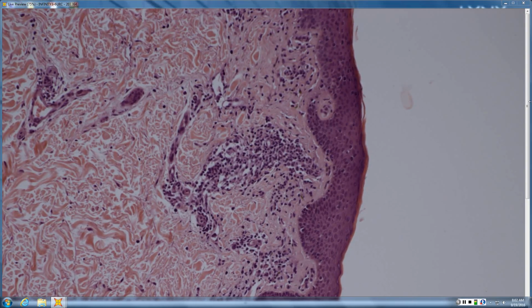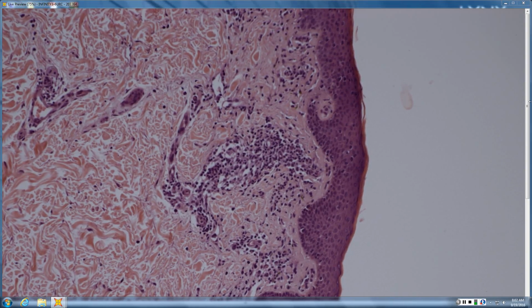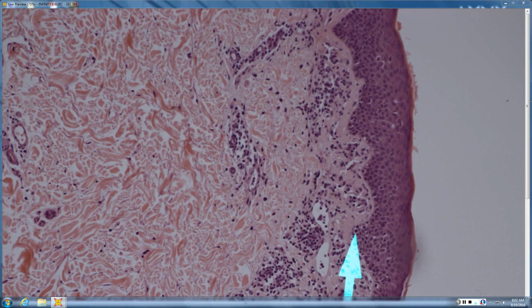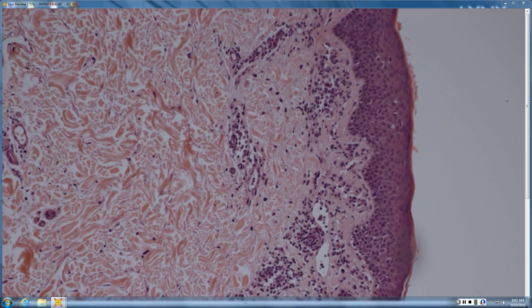In MF, it's distinctly to the top of the vessel, towards the epidermis, with a bare underbelly beneath the vessel. So one more time. Interface dermatitis, lymph in every hole. The lymphs are larger, darker, more angulated than the benign recruited lymphs below. There's papillary dermal fibrosis, compact corneum, bare underbelly.